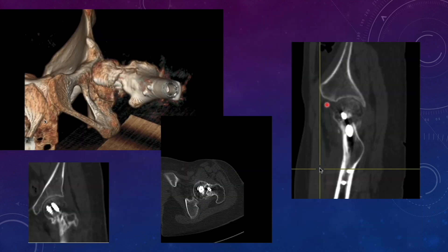A CT was ordered before starting full weight bearing. On 3D CT, there is good bone formation along the calcar with continuous bone visible in that area. On the coronal cut, bridging bone formation is seen. On the axial cut, the anterior bone is also bridging. And on the sagittal cut, the calcar is continuous — meaning the bone has completely bridged the calcar area, so we allowed the patient to bear weight.